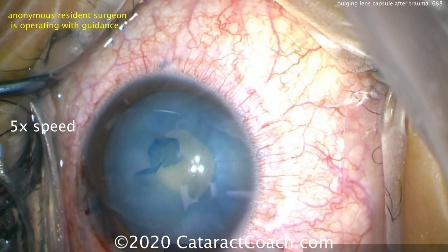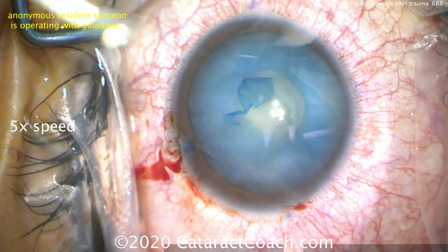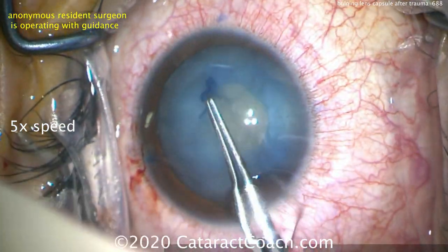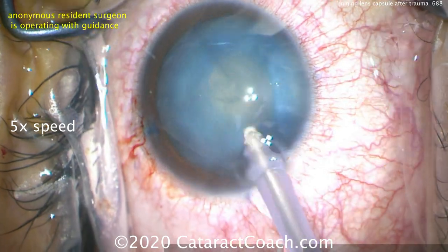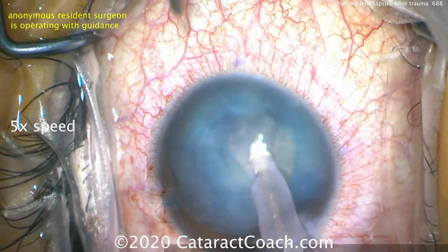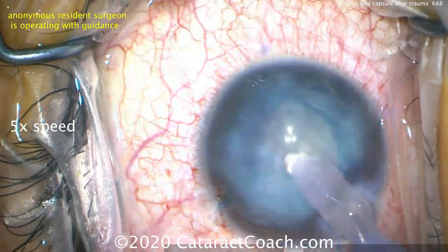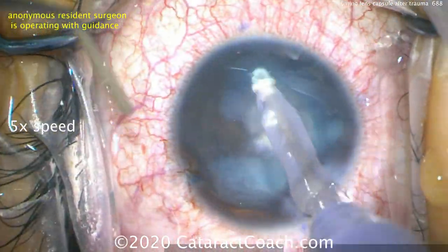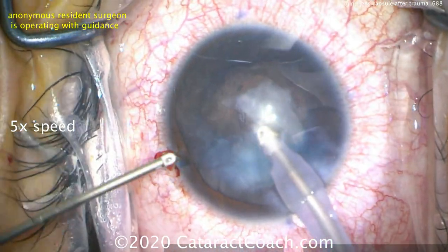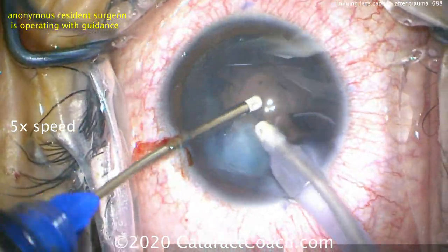Again, we can just use the IA probe to remove the lens material — this does not require any phaco energy whatsoever. We'll take out the lens material through this small capsular opening; you can see the small central opening is continuous, and because it has that round continuous edge, we know it is strong and won't radialize. Placing the IA probe tip within the capsular bag allows us to aspirate all the lens material, though it's a little tougher to work through a very small capsulorhexis opening. A bimanual technique is very helpful here.